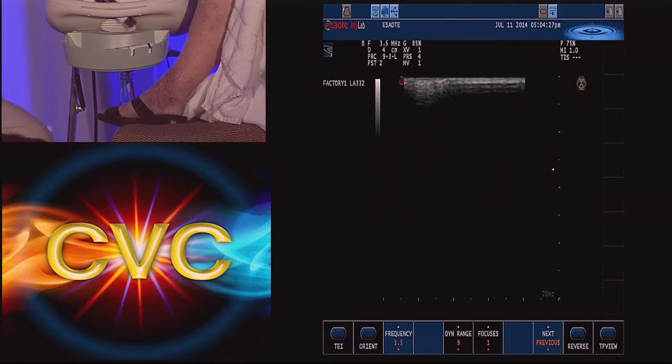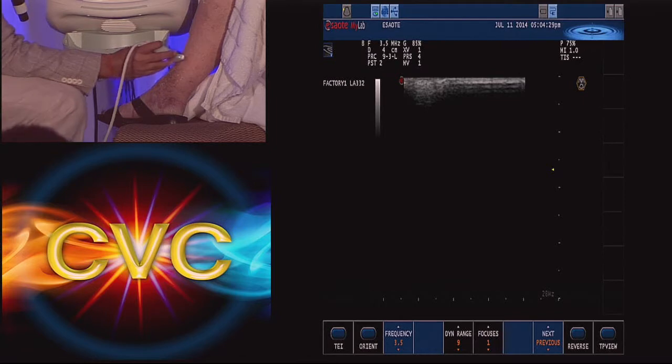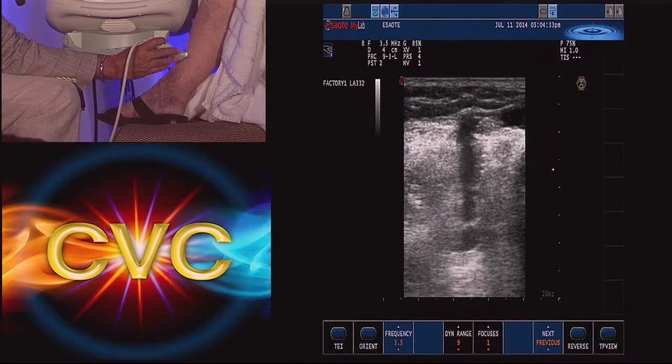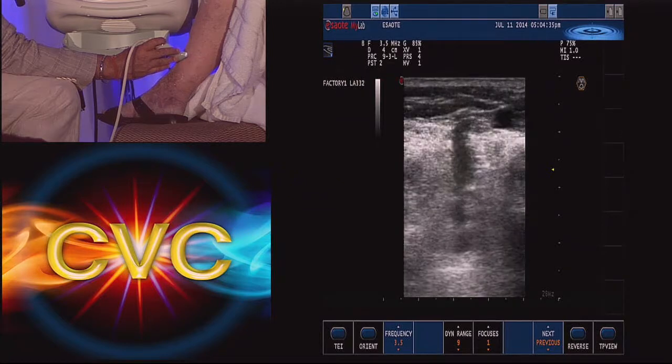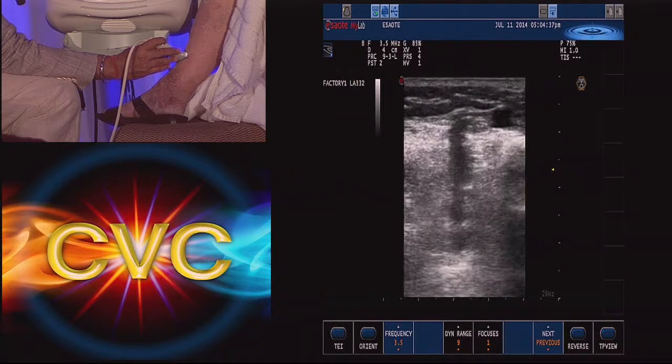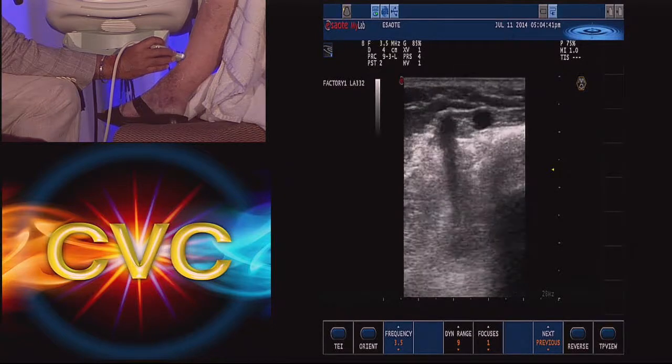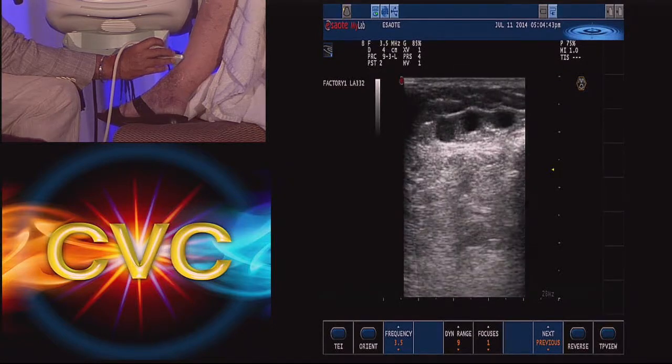Where would you take the catheter for the perforator? See where it's going through the fascia right there, the top? That junction right there. Okay, very superficial. And you can see these are the branches feeding right out of that spot.